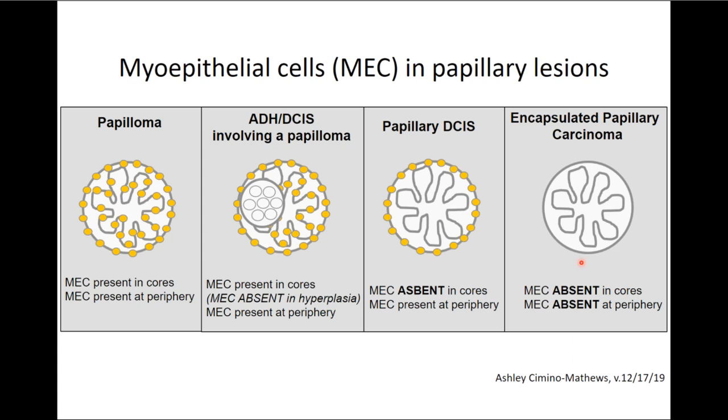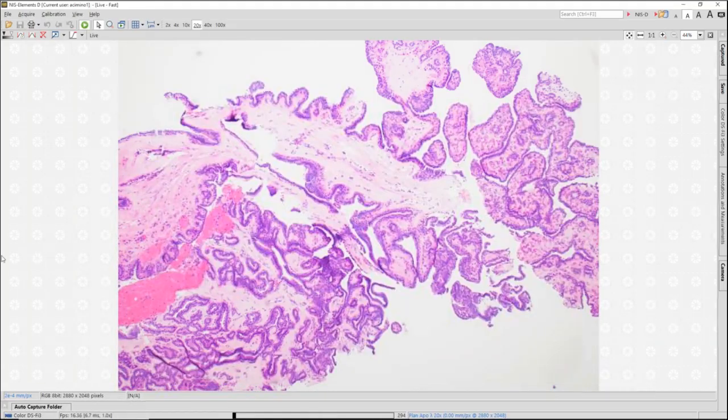This is important clinically because it could be a large lesion, yet carry a very minimal to no risk of metastatic spread. So we'll revisit this again when we look at conventional invasive carcinomas that can arise out of encapsulated papillary carcinomas. But I want to emphasize again that these pure encapsulated papillary carcinomas should be staged as an in situ lesion.